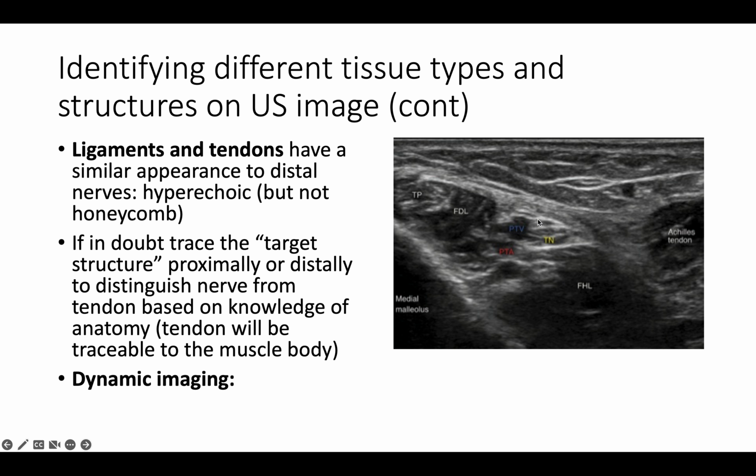And sometimes the tendon here looks like a nerve too, right? The tendon of flexor hallucis longus. So sometimes, in order to distinguish those, besides knowing anatomy and position, Tom, Dick, and Harry, right, you just have to track those structures.